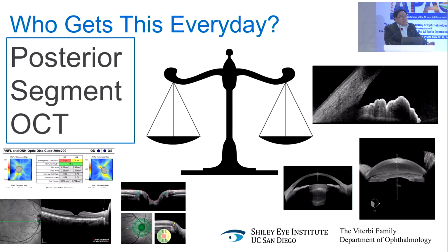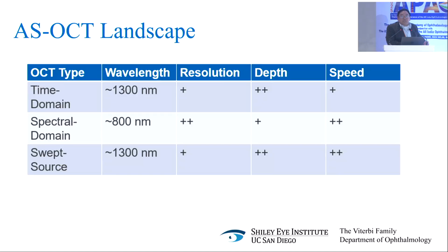The thing is, you probably realize that posterior segment OCT in general has way more utility, both clinical and research, compared to anterior segment. So the question is, have you ever wondered why? Because if you understand why, then you know the problem, and how do we actually fix this, right? So let's just go through this historically.